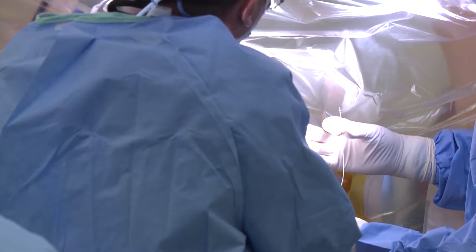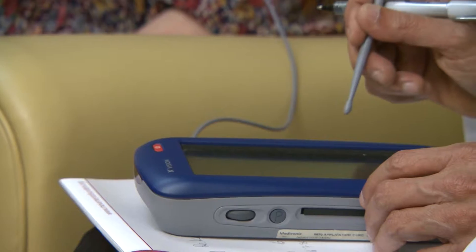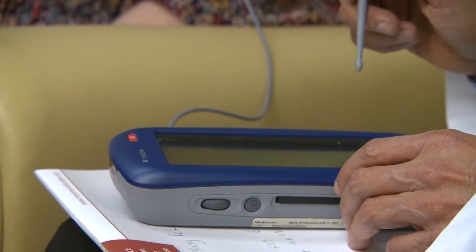So programming a patient — we put an electrode into the target structure. That electrode has got four smaller electrodes, or contacts as we call them. The initial programming is actually interrogation of these four contacts to decide which is the best contact for that patient, that would give the maximum benefit and very few side effects.